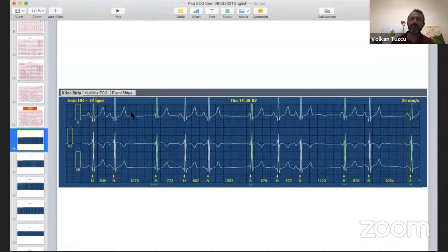A few things are right. So first of all, we have two sinus beats, right? And then we have a little pause. And what is this? Same QRS, okay? The same QRS is actually junctional. Why? There's a P wave, but still junctional. Because normally this patient conducts with this PR interval. It cannot shorten too much. This is too short. Before the P wave ends, the same QRS starts. So it's not ventricular. It's a junctional escape coinciding with the P wave.